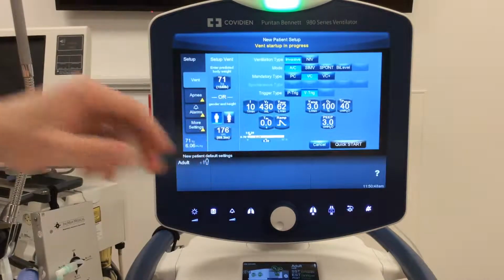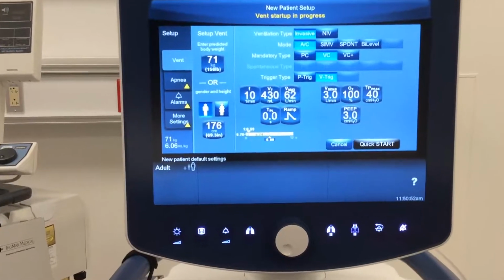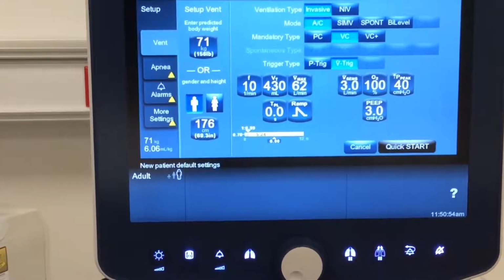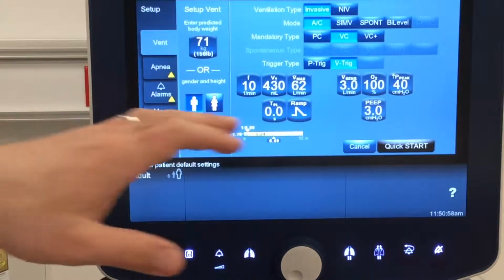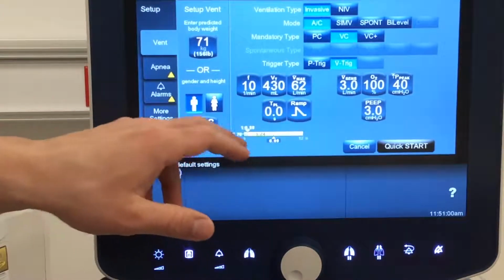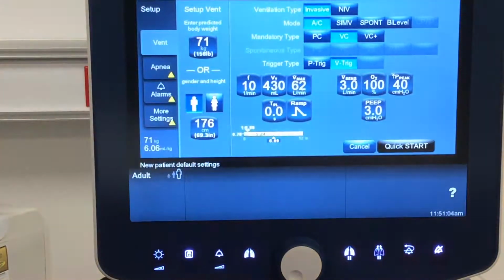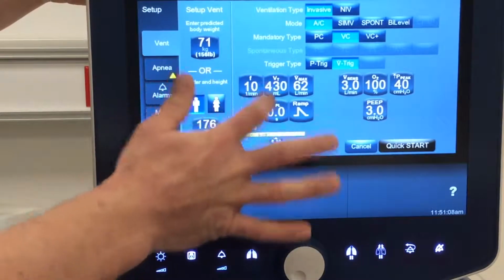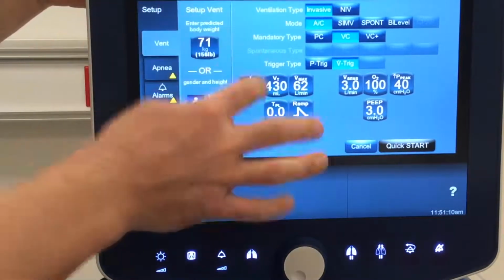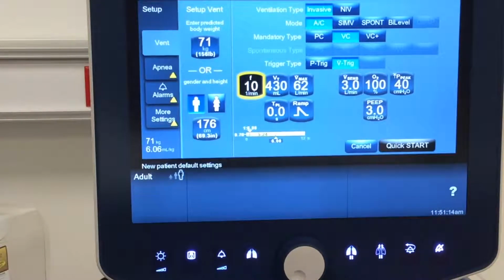All right, so down here at our core settings, let me zoom in so you can see this a little bit better. I'm having to be my own cameraman here. One thing that's nice about modern ventilators is it makes it where we don't have to calculate as many things, okay? So once I've got my mode type and my control variable, and my trigger type and everything like that, it gives me the ability to set these core settings. So we'll talk about what is a core setting that we're manipulating in volume versus a core setting in pressure ventilation, okay?